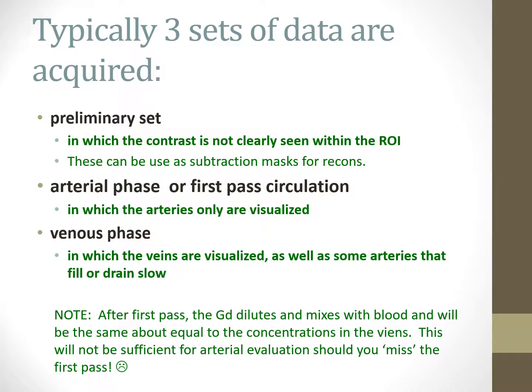It is quite upsetting to have to explain to the patient and also to the radiologist that your timing was off and the vessels were not visualized. But we take our responsibilities where they lie, and we just get the patient to come back in for a repeat scan after the contrast has had time to adequately leave their system.